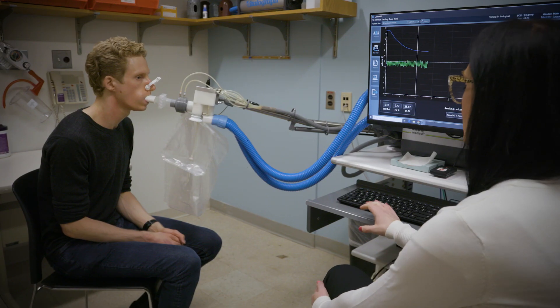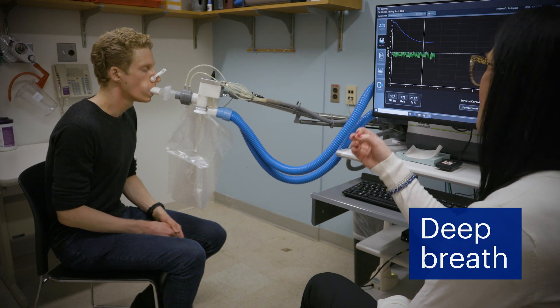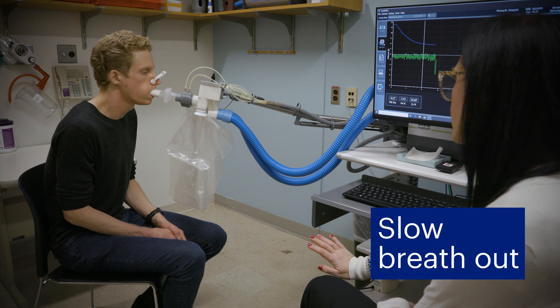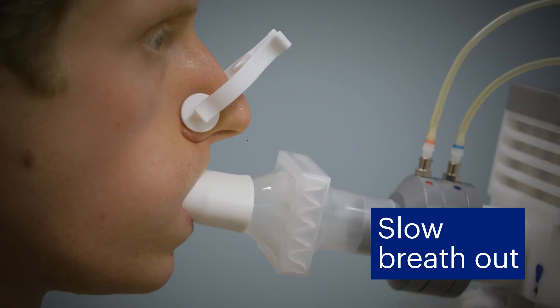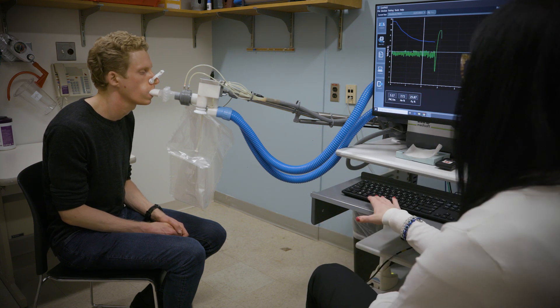After a few minutes, you'll be asked to take a very deep breath all the way in, filling your lungs completely, and then slowly breathe out all the way until there's no more air left in your lungs. You will need to continue breathing out until you're asked to stop, even if it feels like you have no more air left.